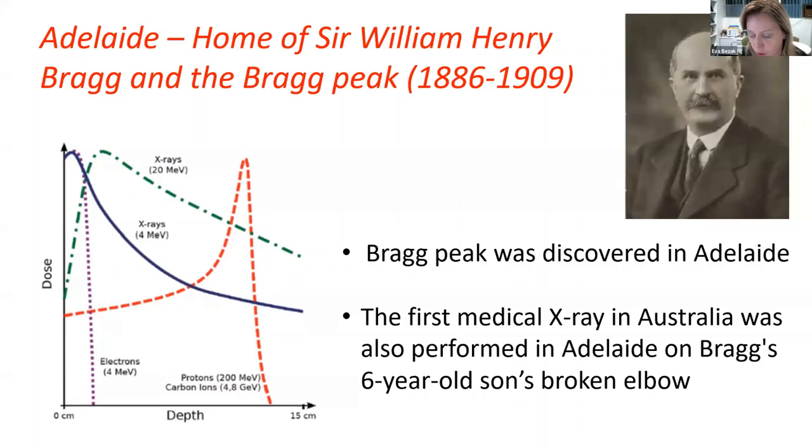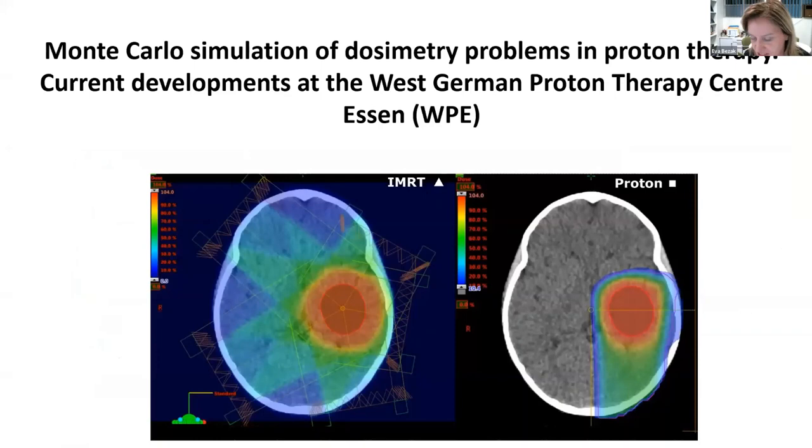We all understand that accurate radiation delivery is a must. However, several factors contribute to the overall accuracy of treatment, including algorithms used for determination of ionization chamber quality factors and for computation of absorbed dose distributions in patients. In this context, Monte Carlo methods are considered to be the state of the art.